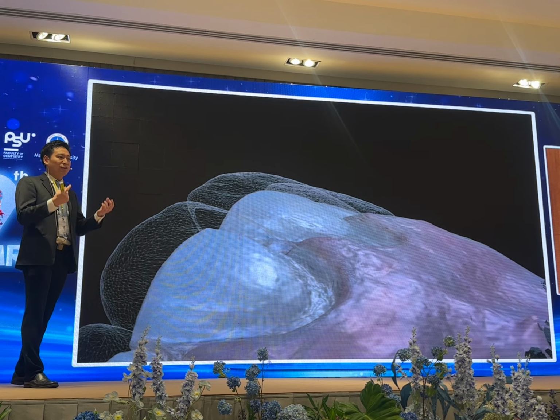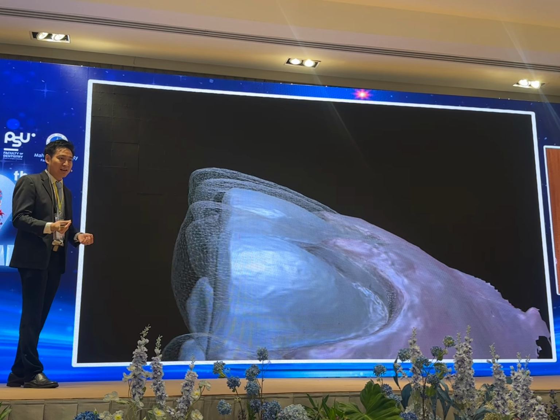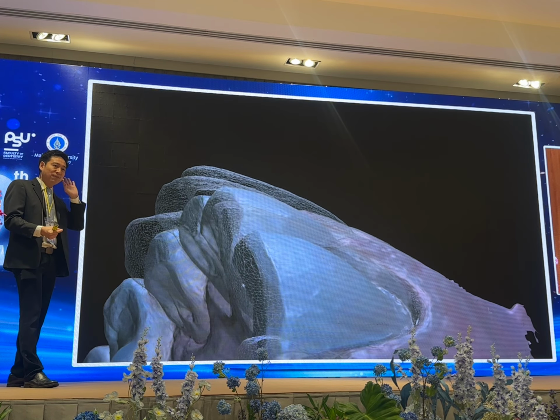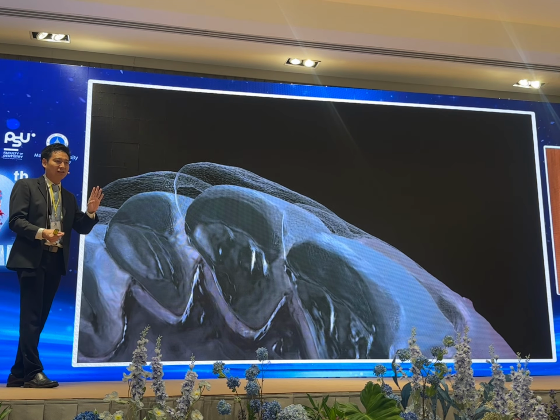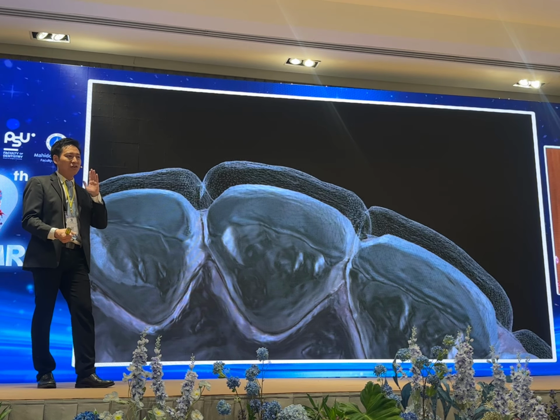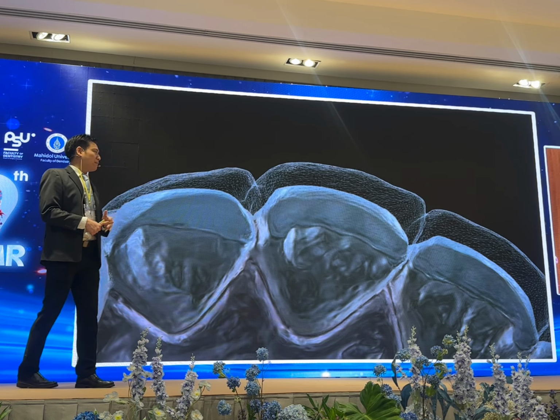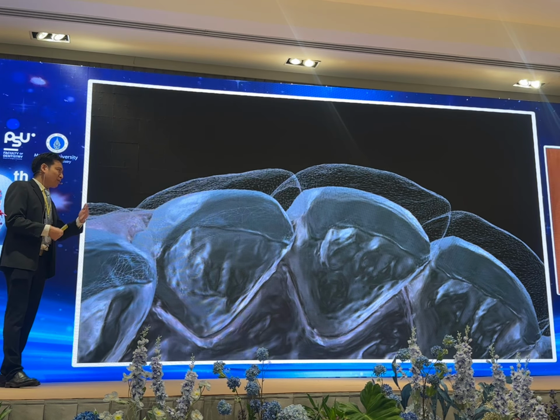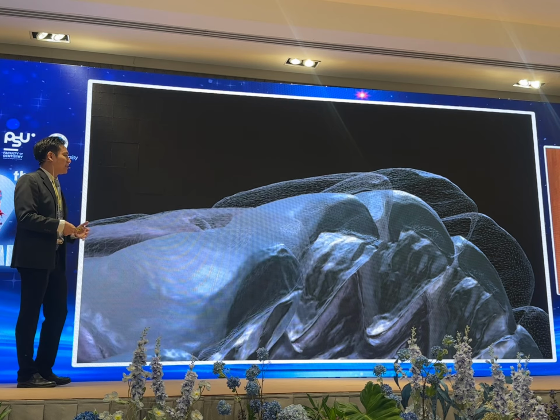Because sometimes you want to increase the thickness of your restoration a little bit because of the color or shade of your abutment. You need to increase the thickness of the restoration. Or sometimes you notice the patient wants a natural look, like a natural smile, and the color of the abutment is not that dark. So you can manipulate the thickness of the restoration a little bit because you see this.